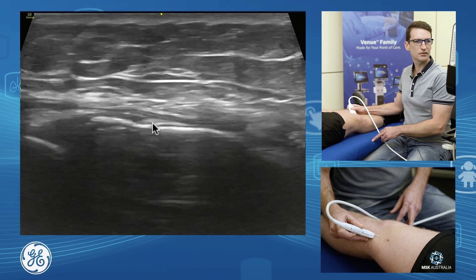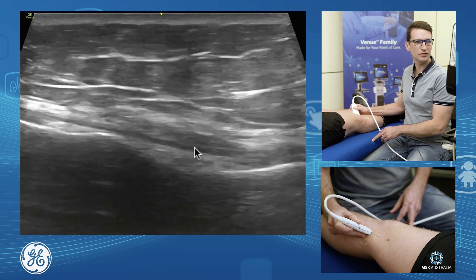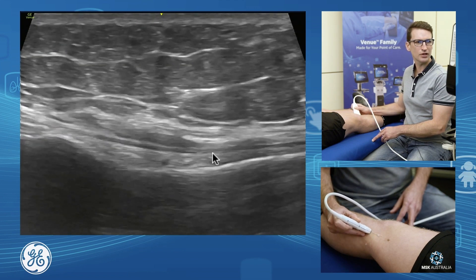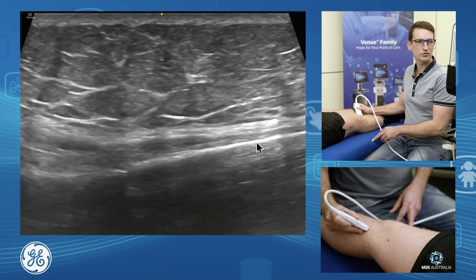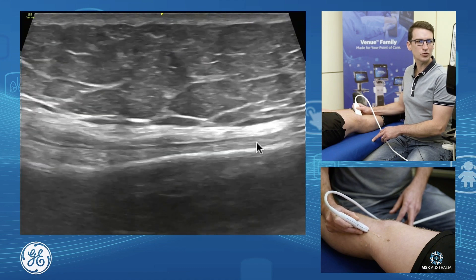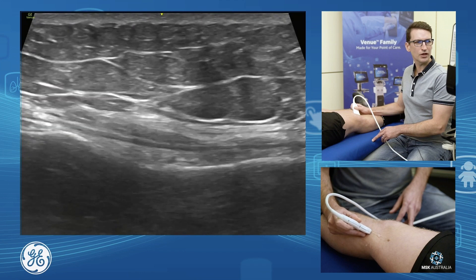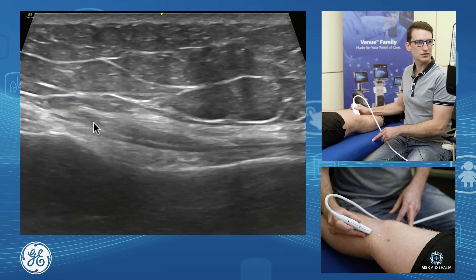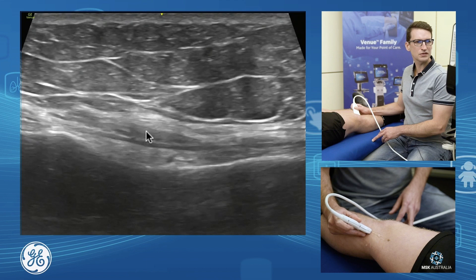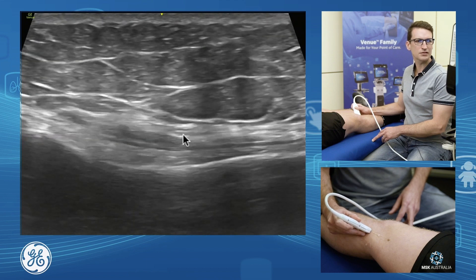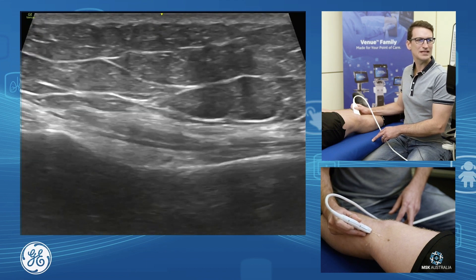As we continue down, we can see our ligament continue down over our tibia and inserting onto our proximal tibia. Over the top we have three tendons: sartorius, gracilis, and semi-tendinosus.